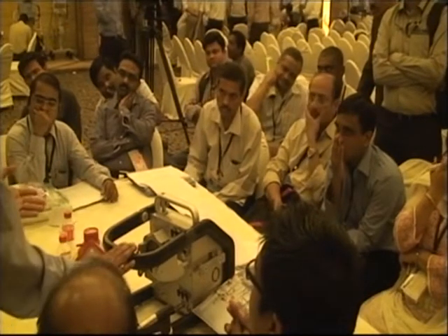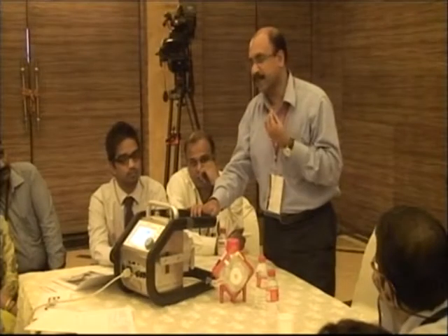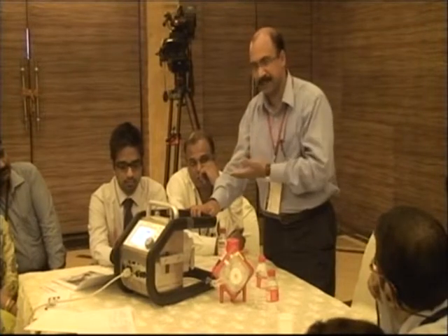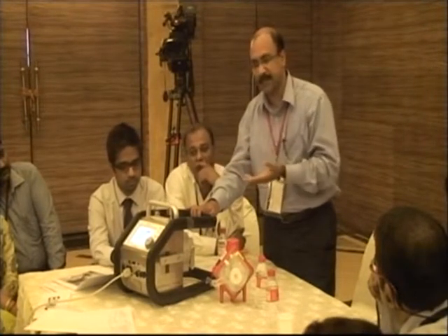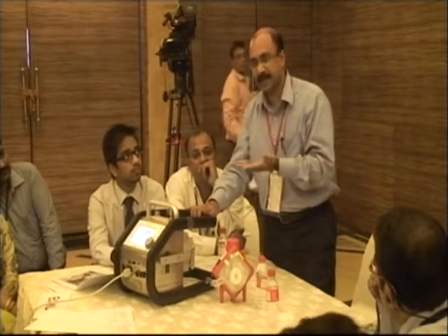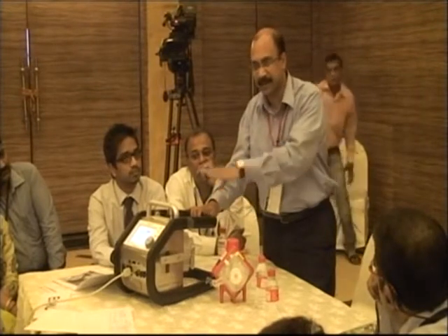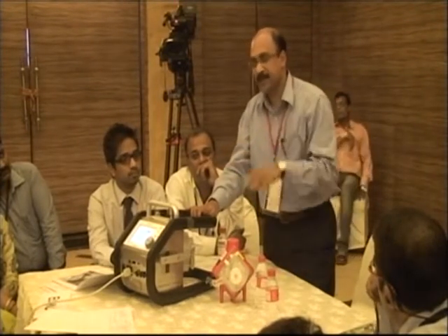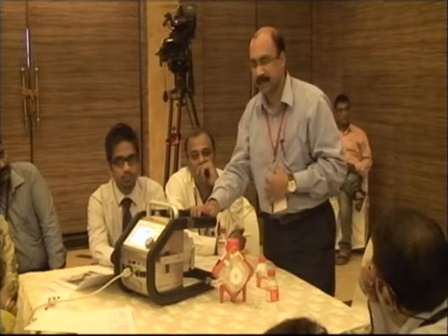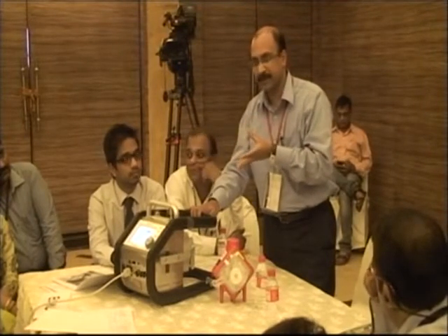Who are the people involved in ECMO management? It's purely a cardiovascular surgeon, because he is the one who can cannulate the patient, a perfusionist who runs the machine, and the intensive care specialist who monitors the rest of the parameters, the specialized nurse who can deal with the surroundings, and obviously you need to have a good blood bank and a laboratory to assess the biological markers. So these are the few people who need to be involved.